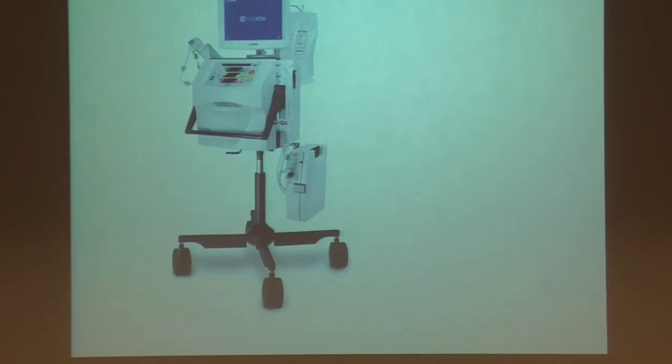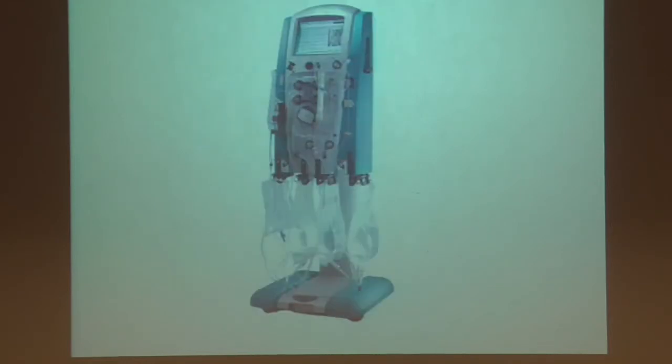And that's essentially, so anytime you read any CRRT literature, you're talking about how much therapy fluid you want to run through the machine. And so those machines just work differently. So if you're reading anything about CRRT, our machines don't do that, but maybe one day if we buy new machines, but they cost a lot.